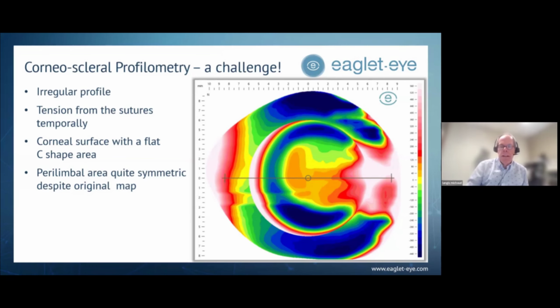They are very tight, and they create a somewhat bulging. And again, from this I can understand why the other sclerals were not successful. If you don't address that kind of particular shape here, especially if you combine this with high depth of the vertical and inferior conjunctiva, you have surfaces that are very, very low compared to the other surface.